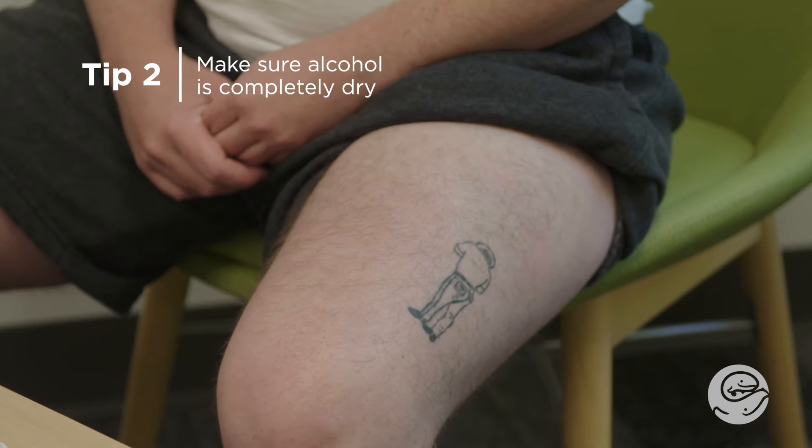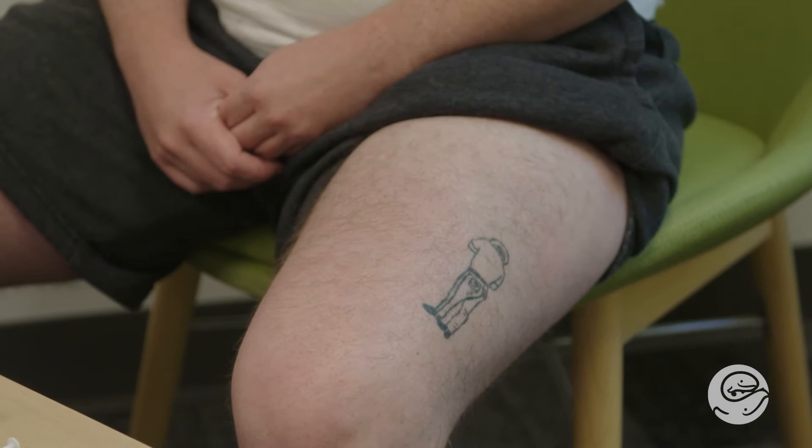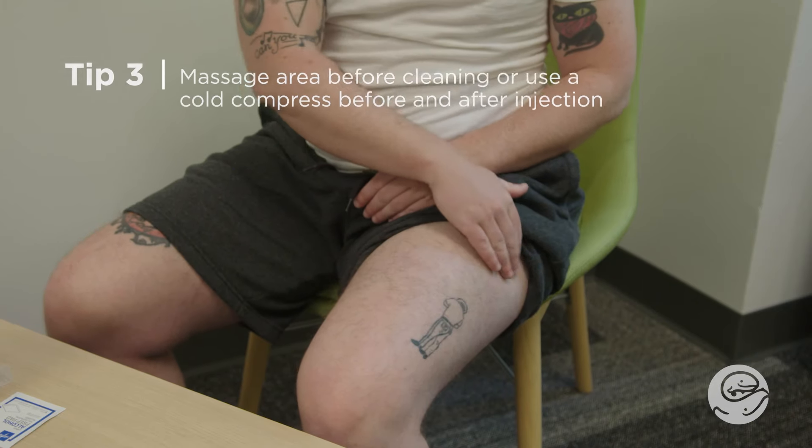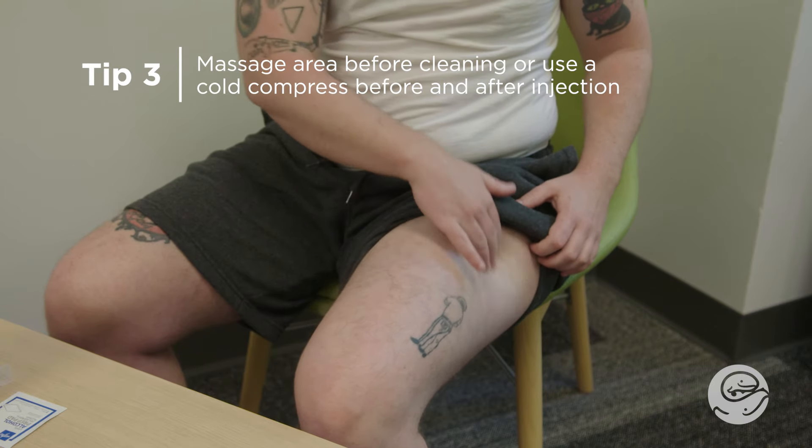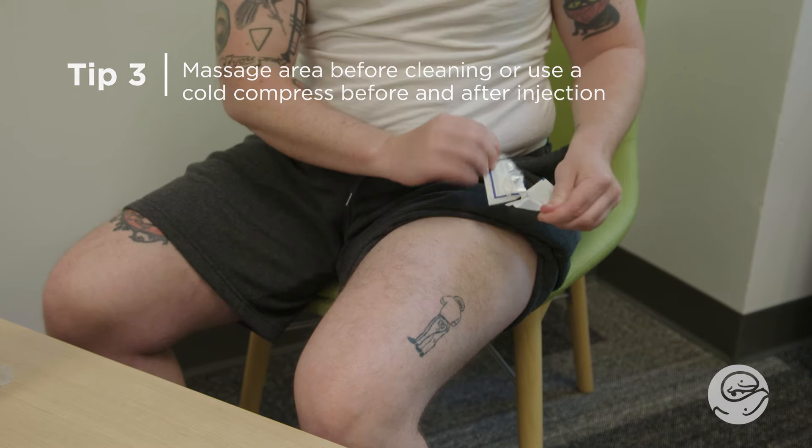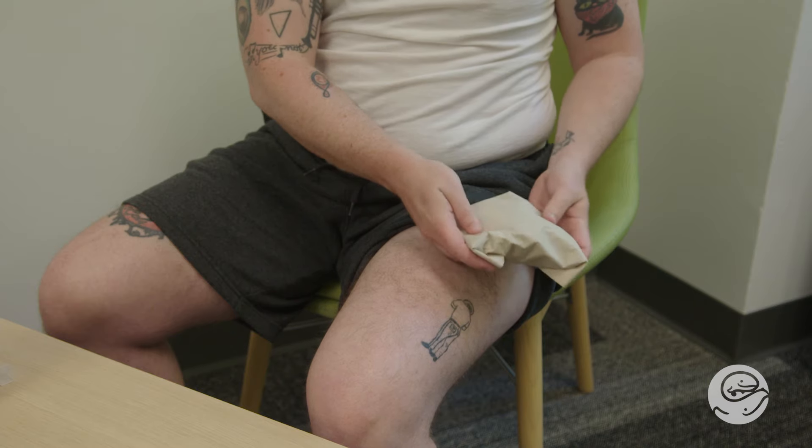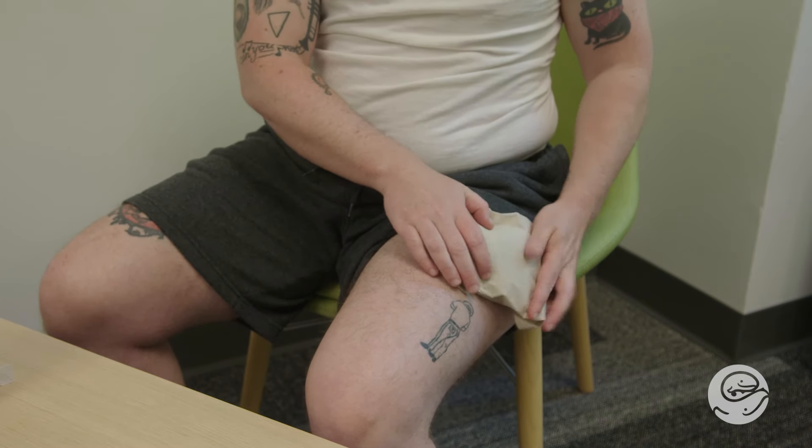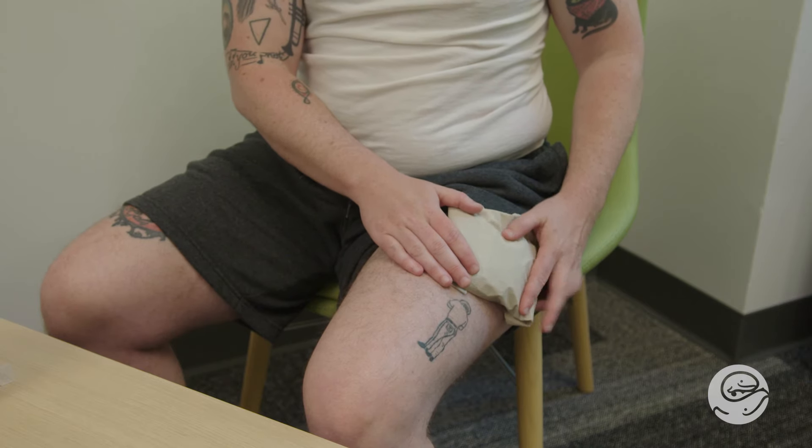Tip 2. Make sure the alcohol is completely dry before giving the injection. If it is still wet, the injection will sting when you give it. Tip 3. You can massage the area before cleaning it to decrease pain. Another option to decrease pain is to ice for 1-2 minutes before giving the injection and for 3-5 minutes after giving the injection. Never place cold packs directly on the skin. Wrap cold packs with a t-shirt or towel before placing on the skin. This protects the skin from getting an injury from the cold.